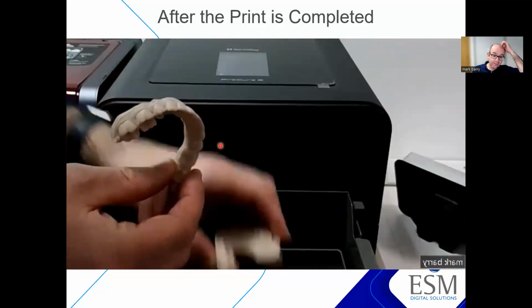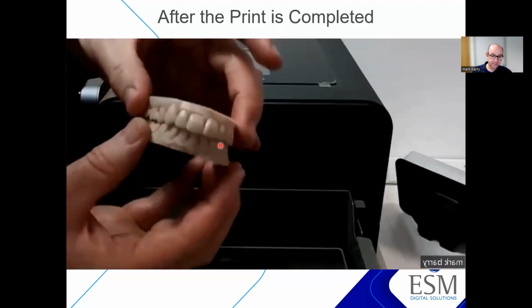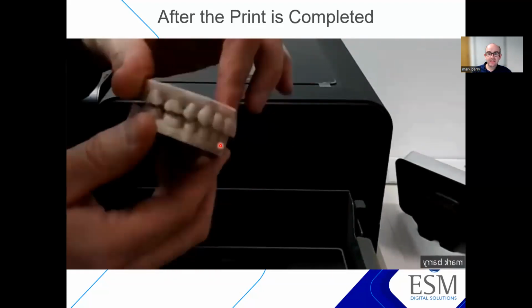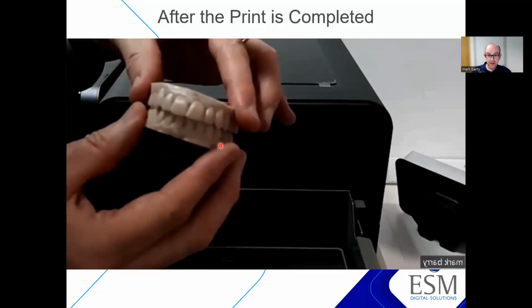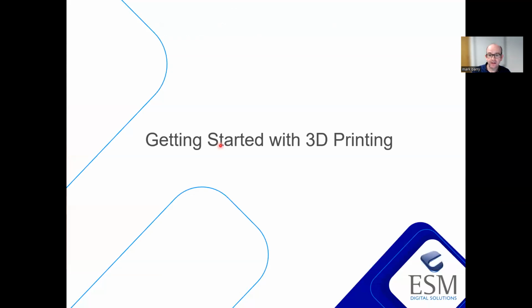In this case, there's no temperature, but if we did need heat, the curing unit would generate that heat, so that the curing will happen at the temperature that it should happen, as defined and agreed by the manufacturer of the material. And of course, SprintRay as well, that kind of two-party validation.